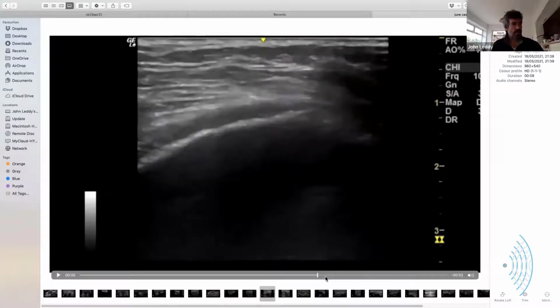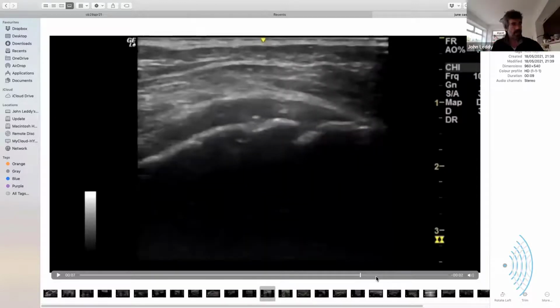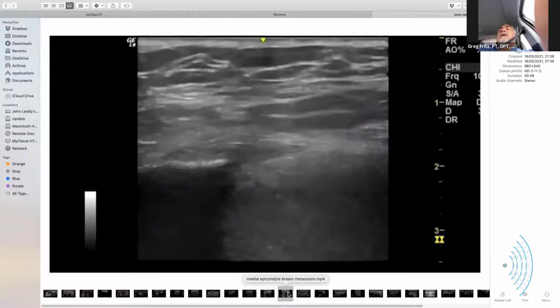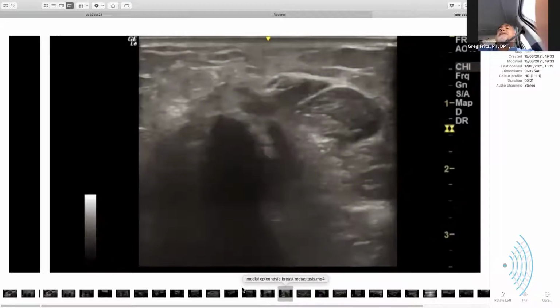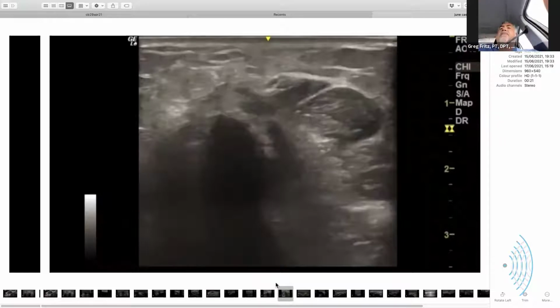Yeah, but do you see how it looks? That's short axis at the rim, right? Yeah, that's short axis at the rim. It's easy to miss. How would you name that? Would that be calcinosis, or would you just leave it be and say there's some periosteal degeneration? I would just say there is some sort of, in inverted commas, tendinosis or fasciopathy, and you treat it a bit like a plantar fascia. Yeah. Or at least think of it in that way.